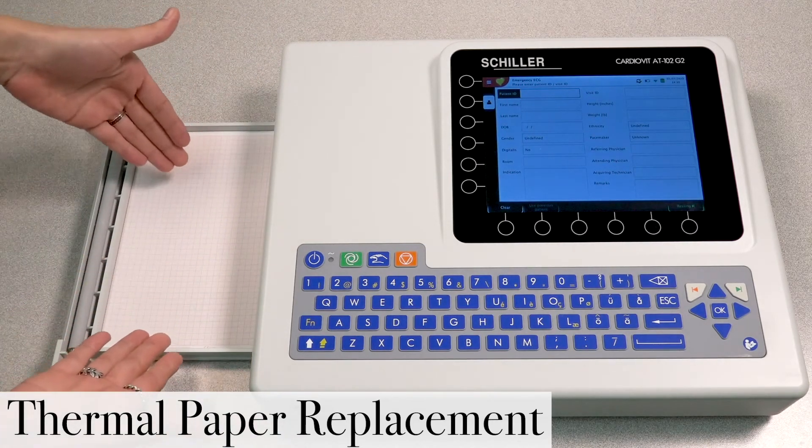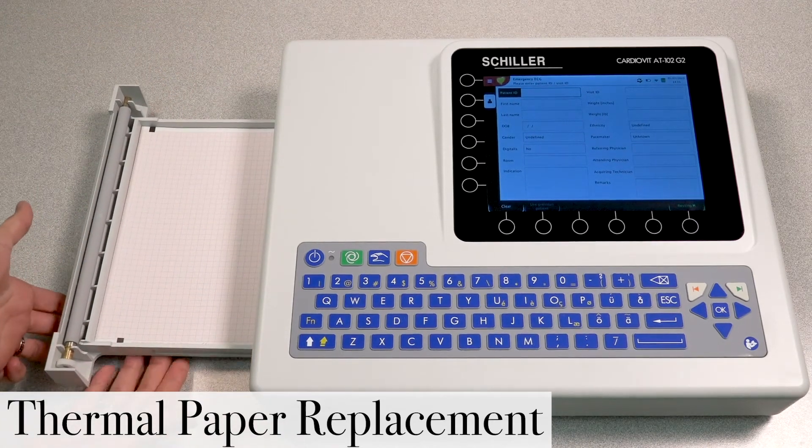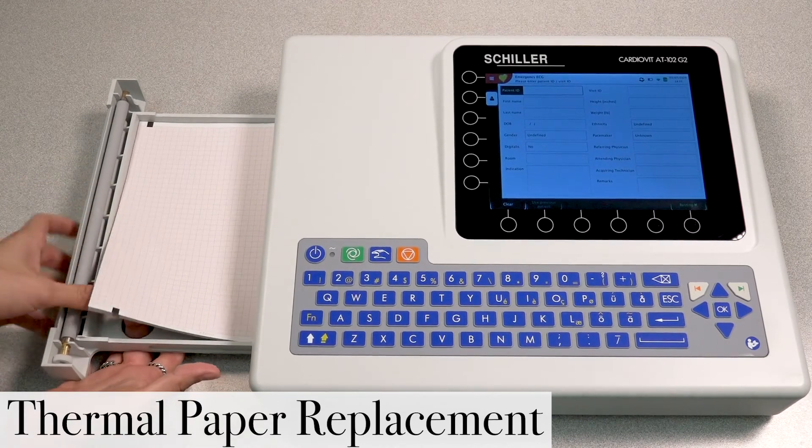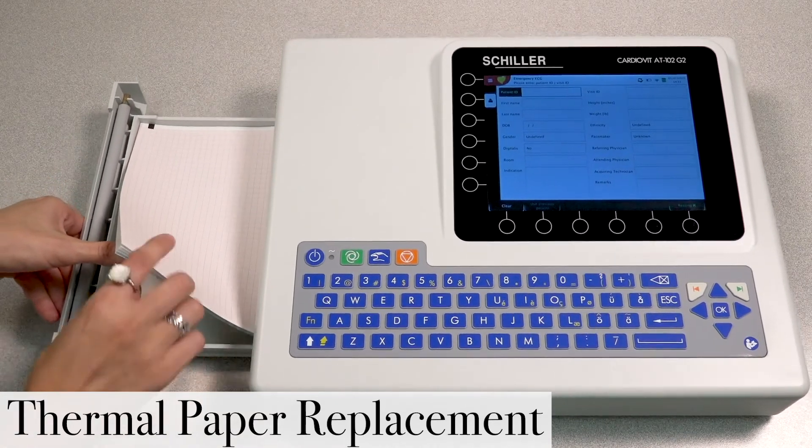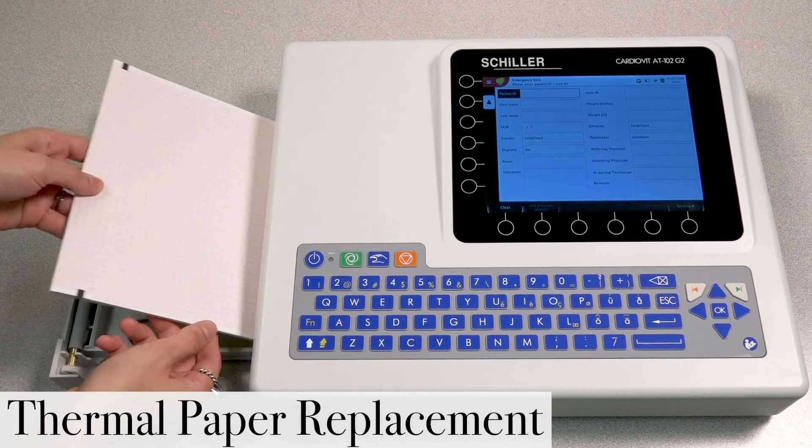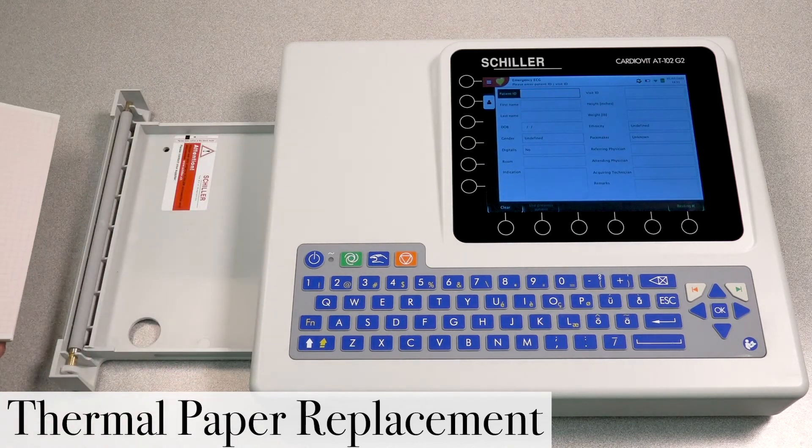That will release your paper tray as you see here. And inside, you'll find the paper. Now, underneath the paper tray, you do have a small circular gap in which you could use to help you remove the paper very smoothly.